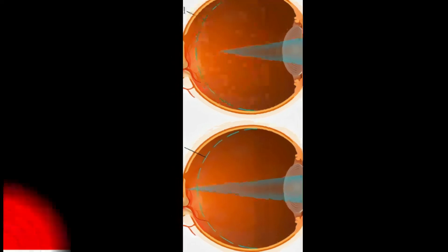The duochrome test is very crucial, especially for myopes. It is based on chromatic aberration, which occurs because different wavelengths of light are bent at different extents. For example, the longer wavelength, which is red, is refracted less than the shorter one, which is green. Therefore, this test tries to determine if we have overcorrected, especially for the myopes. Giving too much power to a myope forces them to accommodate to see, and they will see the green better.